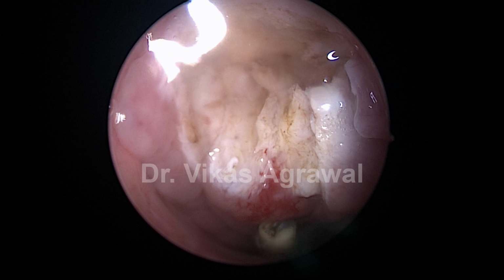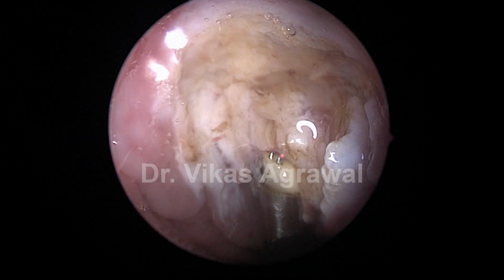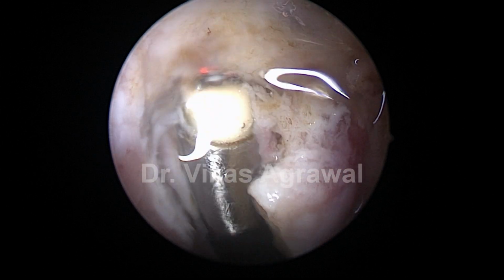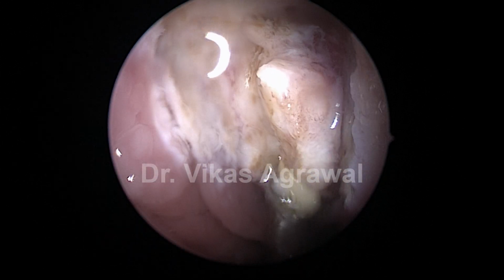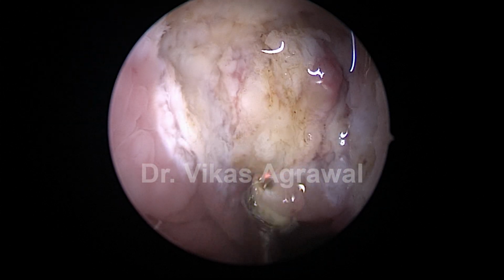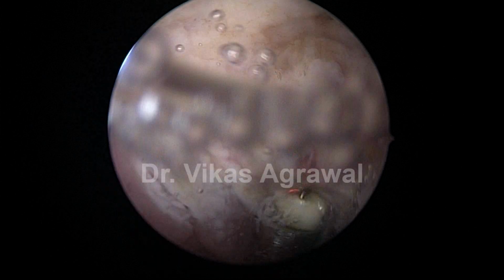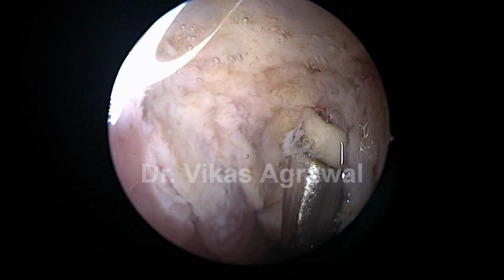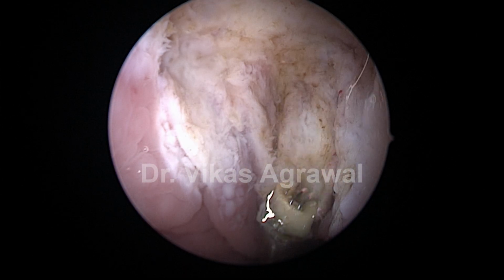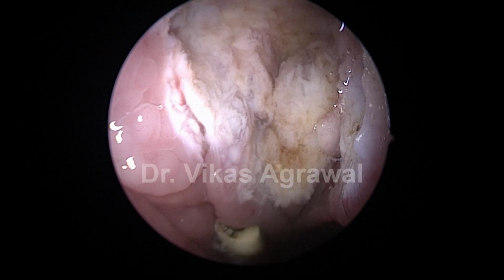In such an adenoid, it is possible that you require a second wand, because this will not be enough to completely remove the adenoids. We might have to open a second wand and we have to be ready for that. Now, quick debulking of all the adenoids is being performed so that so much space is created behind the nose, into the nasopharynx.